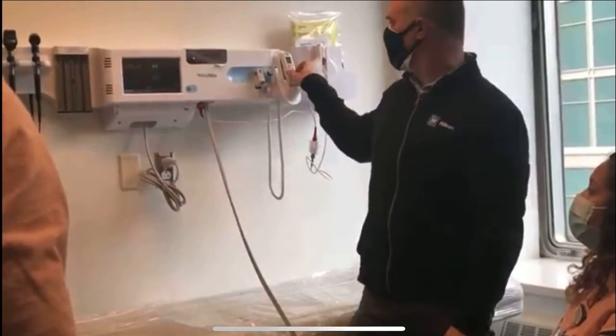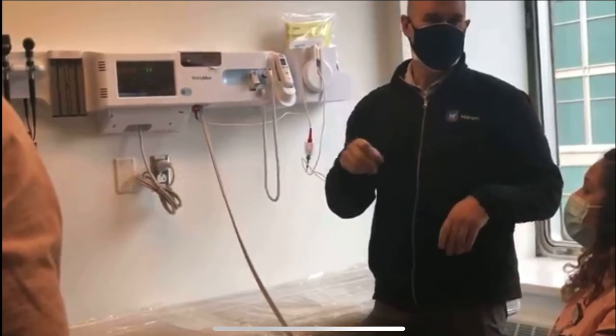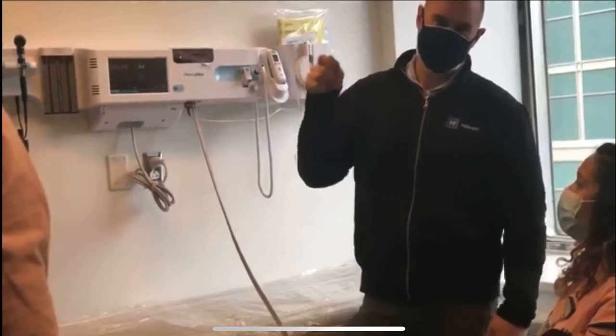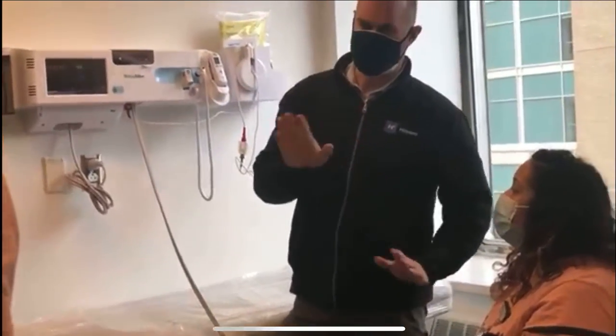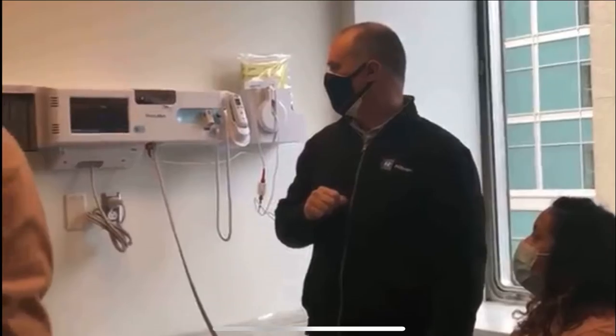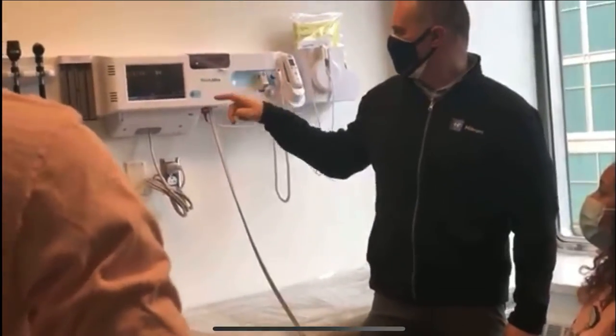You can do the temperature at the same time as you're doing the blood pressure. So if the patient is a little chatty, you can let them know: I'm going to need to do a couple other things here, so just take it easy for a minute. So that's a single blood pressure.